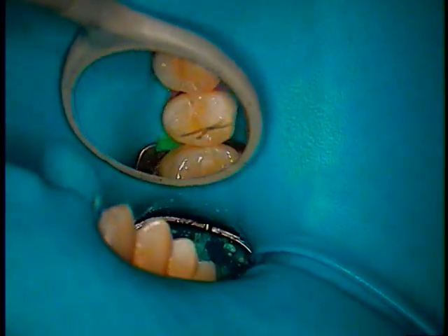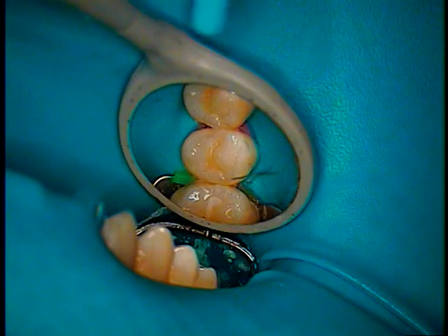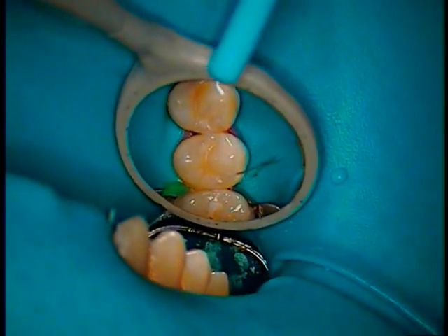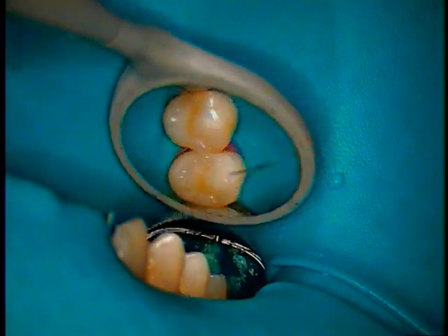This is a Class 2 composite on tooth number 4. Today we're going to address something called the cavity configuration factor, or the C factor, when we place a filling. We have completely isolated this side of the arch. We placed a wedge additionally on the distal aspect of number 4, so we're going to go ahead and prep the DO.